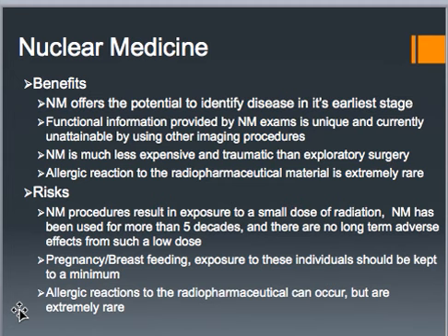So a lot of times what they could do is just pump their breast milk until all that's out of their system. If the patient is pregnant, it's not an automatic we won't scan them. Most of the radionuclides, I think we talk about it a little bit later, it doesn't cross through the placenta to the baby. The risk is through the radiation exposure in the parent to the baby. So a lot of times the biggest risk is the bladder because that's where they pool. So a lot of times what they do is have the patient, if they do have to have a scan when they're pregnant, to drink a lot of water and keep that bladder empty, go to the bathroom frequently so that radiation isn't pooled in the bladder close to the baby.